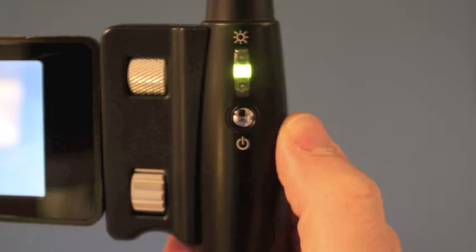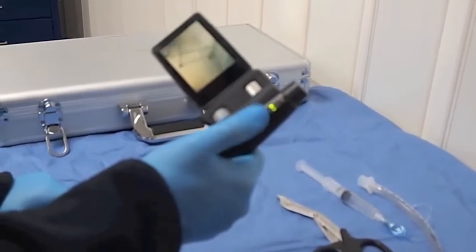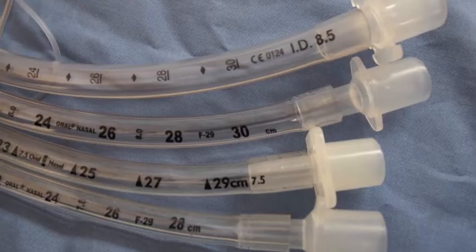To turn on the device, depress the power button and hold until the device turns on. To change from blue tint to red tint, press the button again. To turn off the device, hold the button once again till the device turns off.